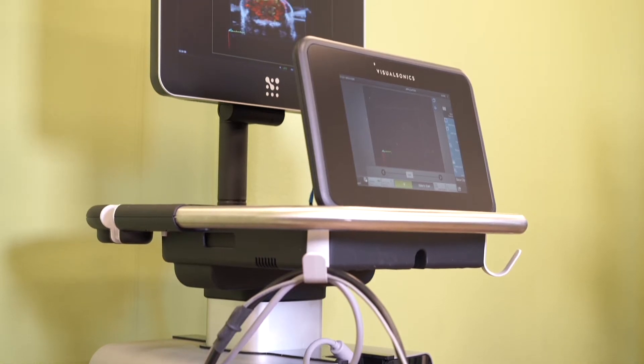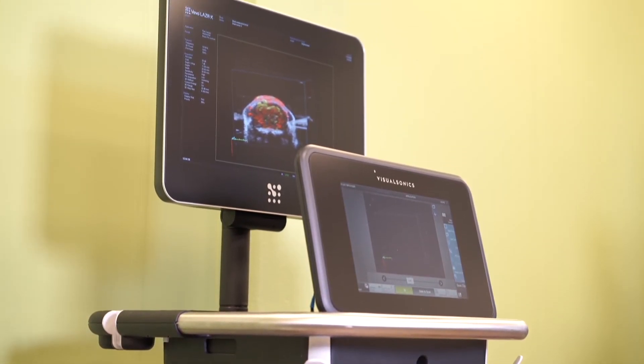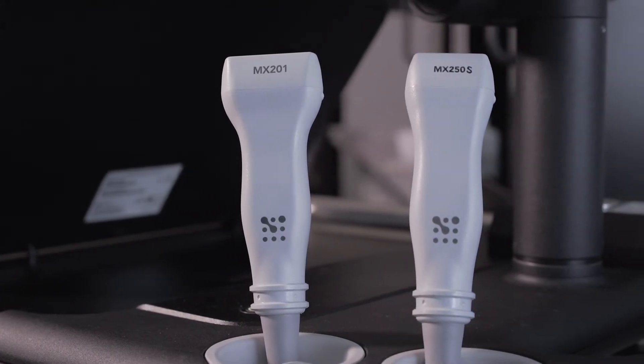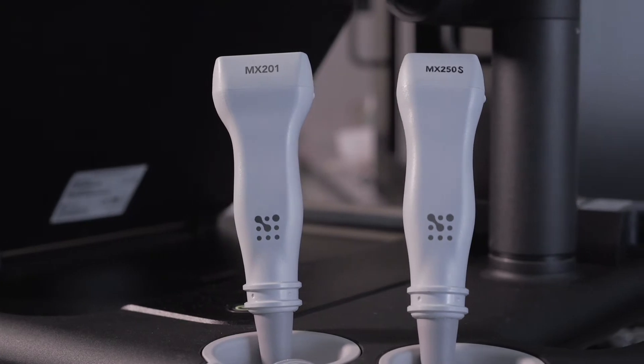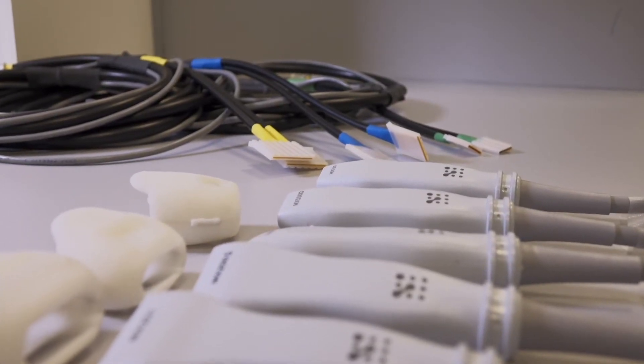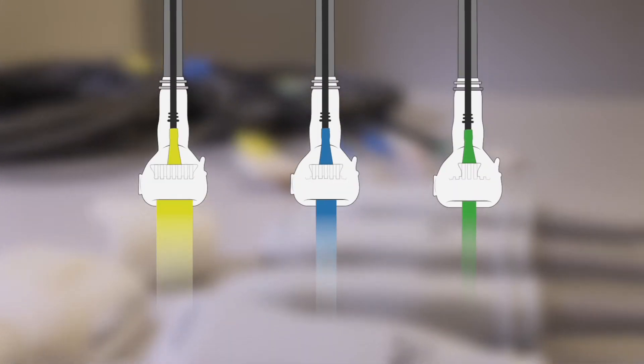The Vivo LaserX is a compact, portable, open access system. We supply a range of transducers from 9 to 56 megahertz to achieve resolutions from 120 down to 30 microns, that work with a selection of interchangeable optical fibers — wide, medium, and narrow — for application specific light delivery.